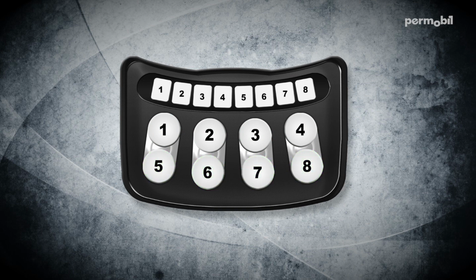In this case, when programming memory, buttons 1, 2, and 3 will be used to recall the stored memory positions. Buttons 5, 6, and 7 are used to save those memory positions. Button number 8 is the button that you'll use to enter and exit the memory mode on the wheelchair. And finally, button number 4 will be used to enter the memory storage mode on the wheelchair.